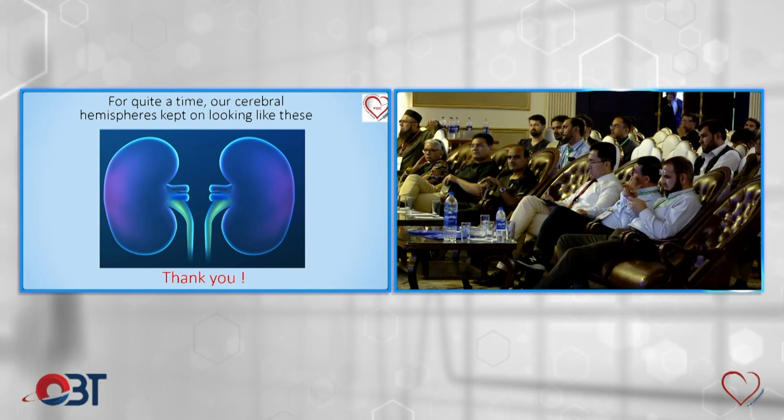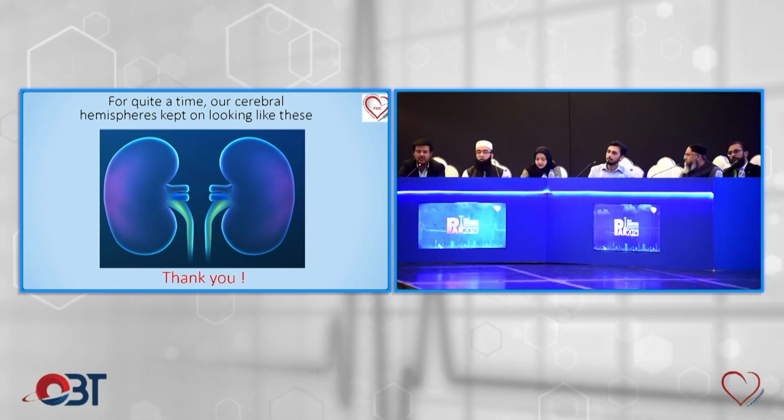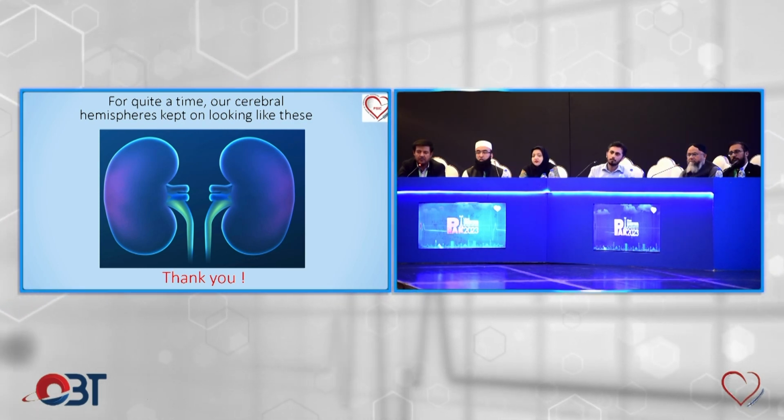Dr. Najam, I have one last question. In such cases, what would be your preferred access site approach? The right radial you can spare for a future arteriovenous fistula. Whether it is preferable to go for the femoral approach.